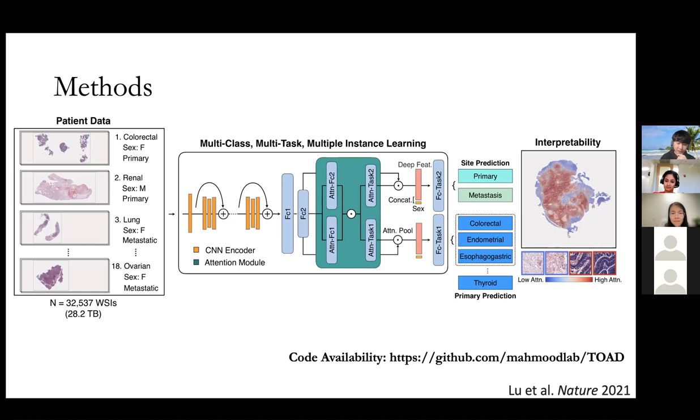And I will also note, sorry, it seems like I'm rambling, but in one of my slides, I mentioned that this is really a two-stage approach, right? So what kind of learning algorithm you apply is definitely one piece of the puzzle. But let's not forget that all of this happens after you've already done embedding on your original data. And that embedding is arbitrary, in the sense that typically people just use a pre-trained encoder, but also in the sense that we took fixed size crops at some typically fixed size resolutions that we've artificially defined for our problem.